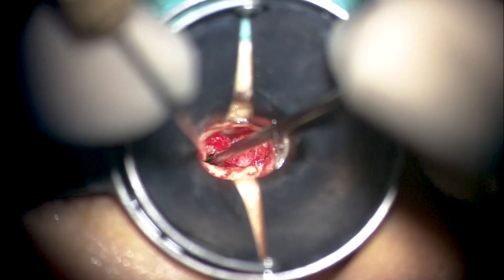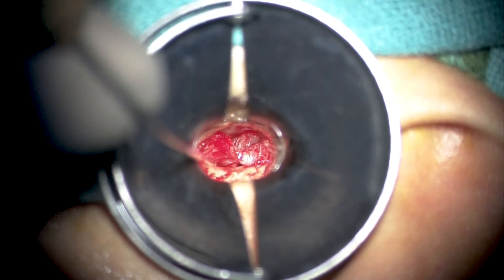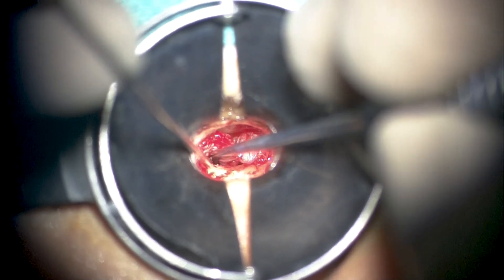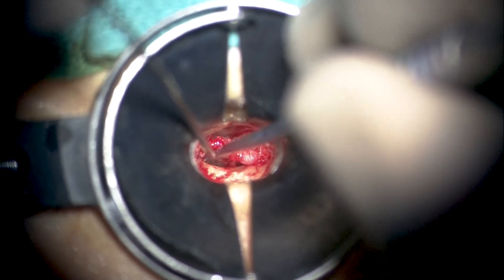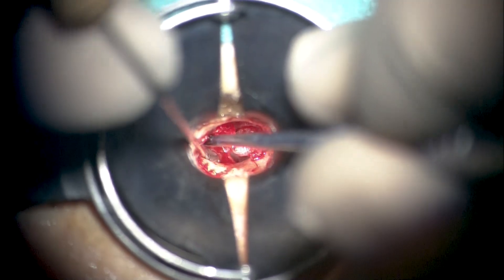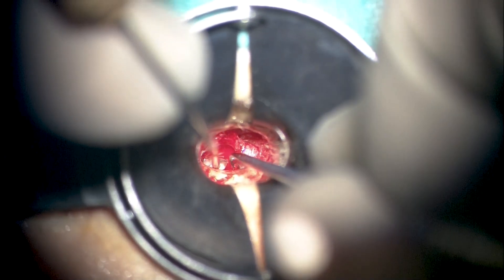To be able to lift this adhered pars tensa retraction pocket from the chorda tympani, we are slightly increasing the breadth of our flap inferiorly so that it is not tightly tethered to the chorda area. We are widening the flap inferiorly, having already done so superiorly over the incus long process. As we elevate the inferior annulus anteriorly, the only part of the pars tensa retraction pocket still unelevated is the one attached to the chorda.